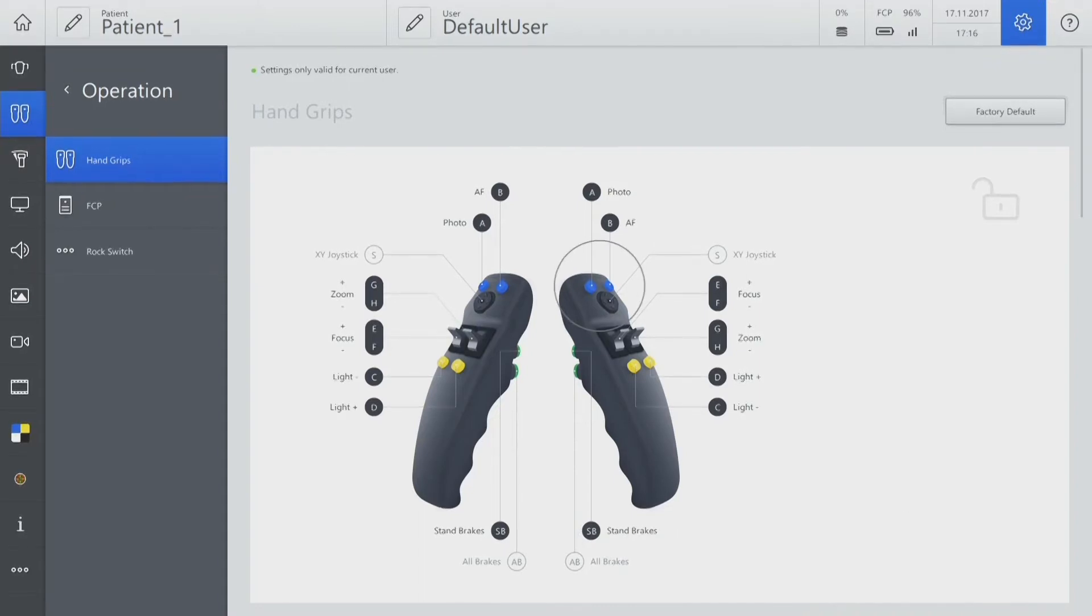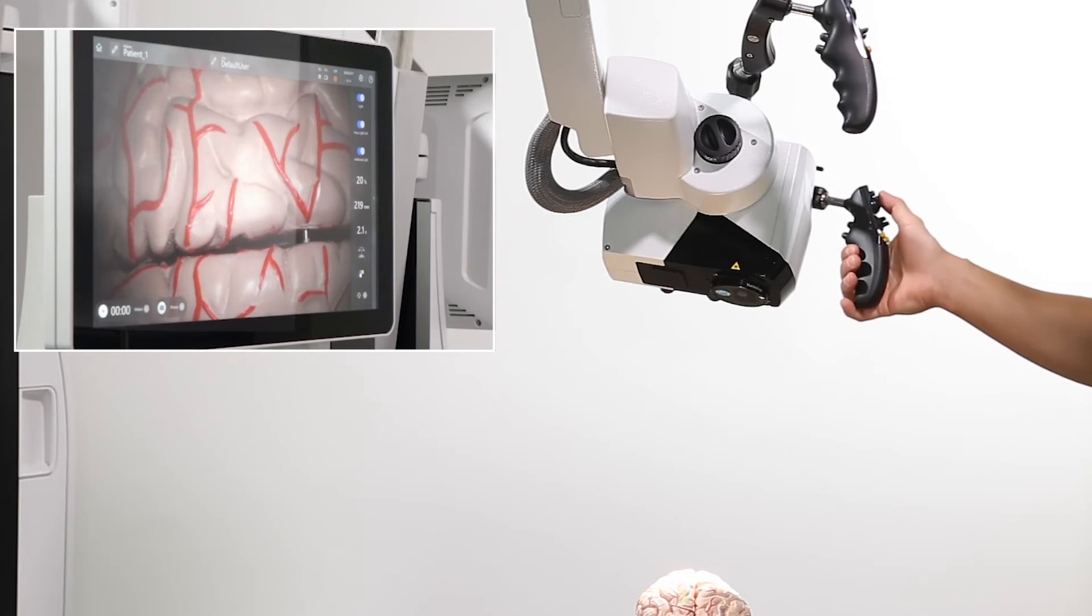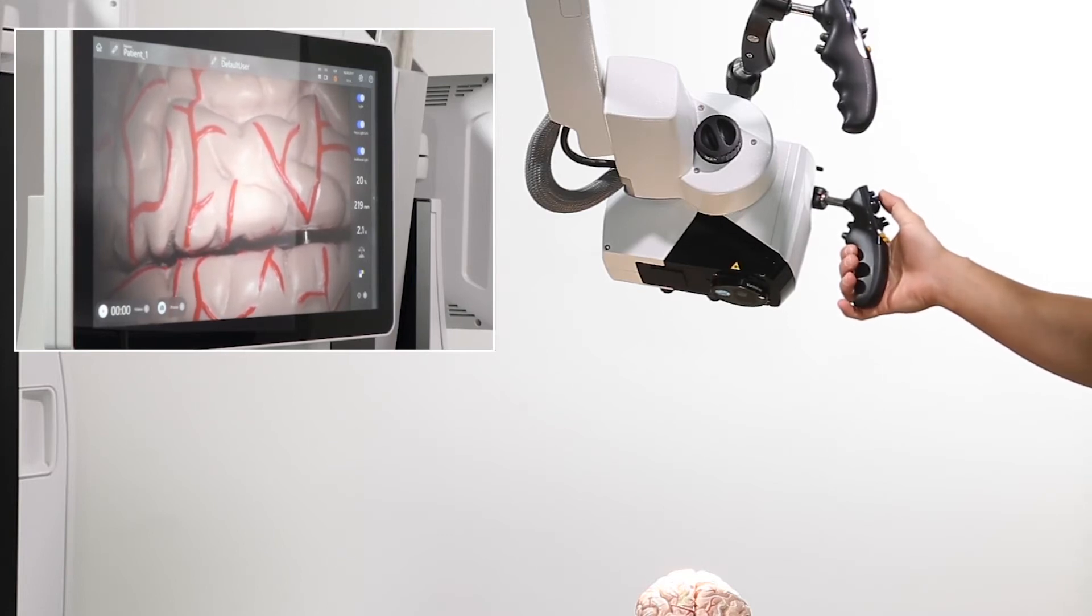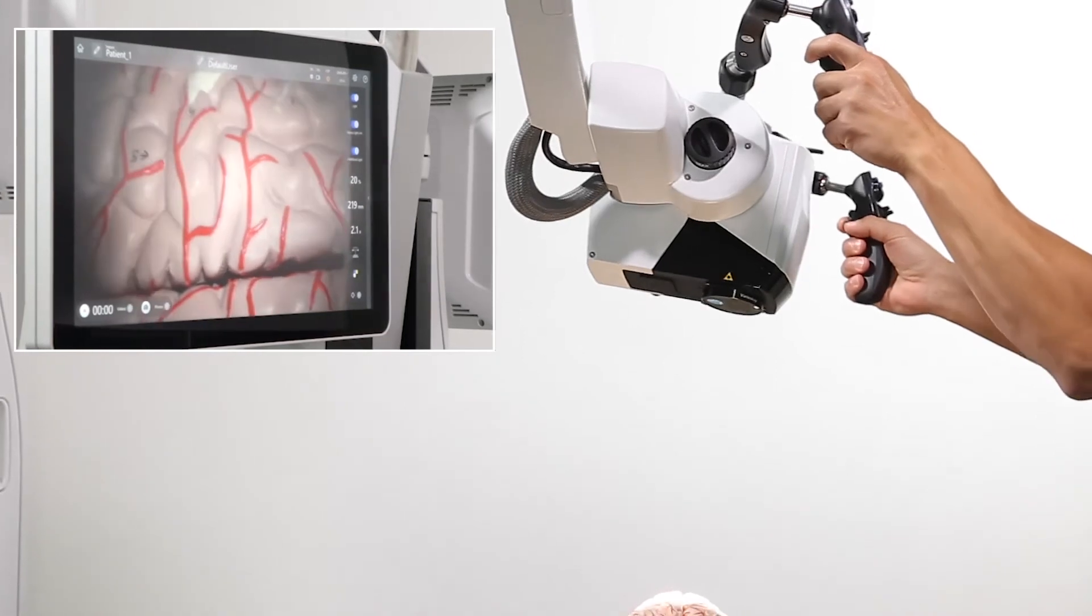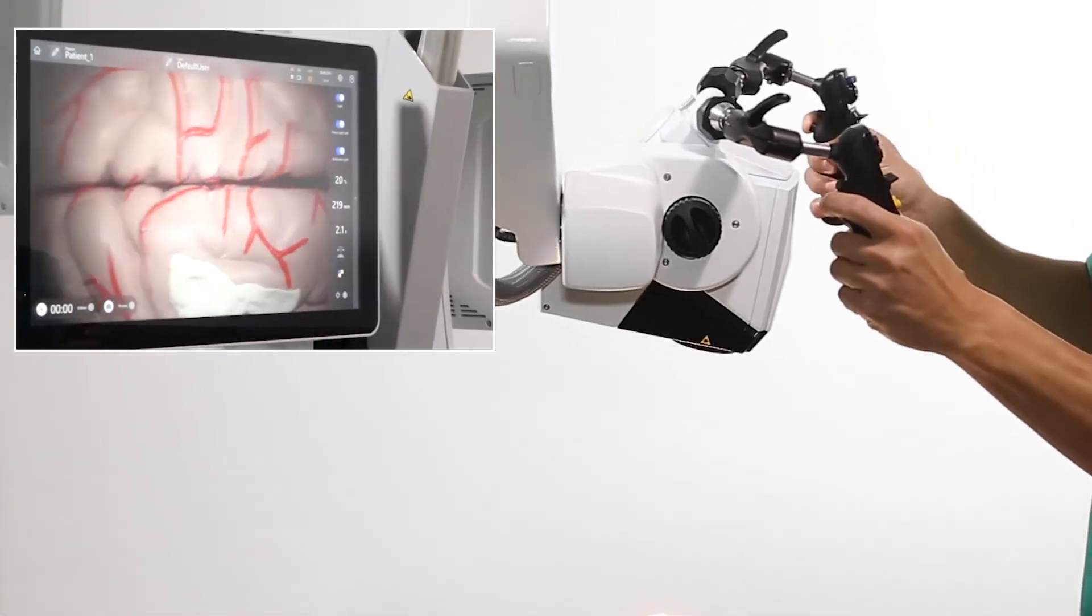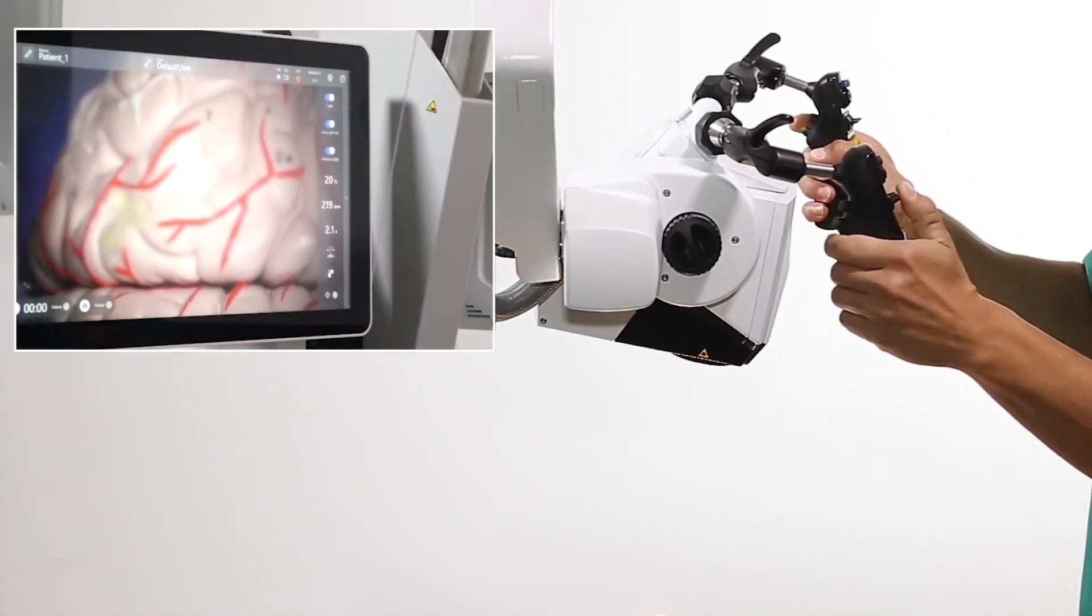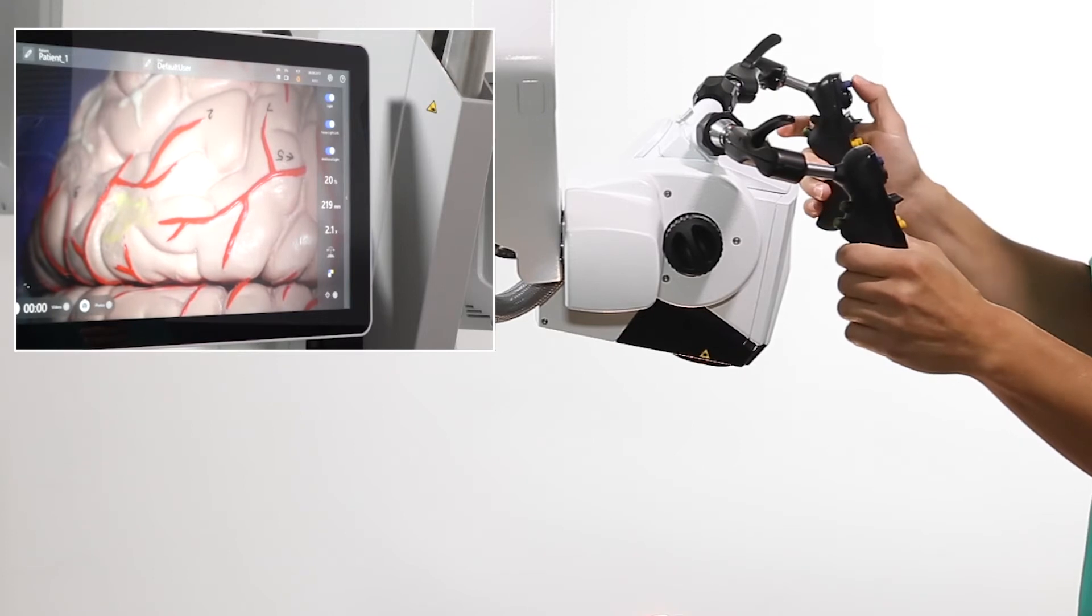To store a position, simply press the Position Memory button on the handgrip. The position is stored within Image. As you continue working, you may want to save another position that you wish to come back to.